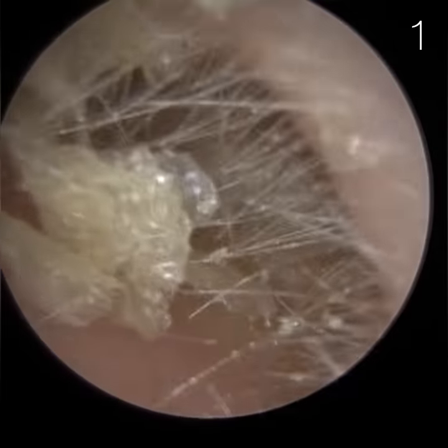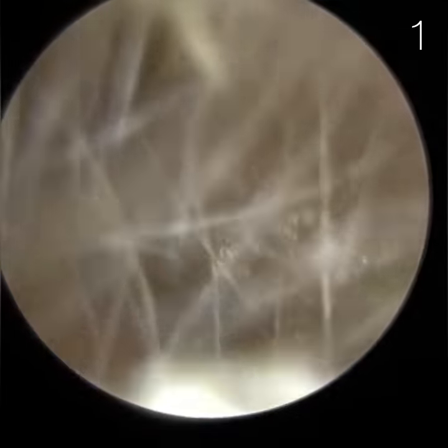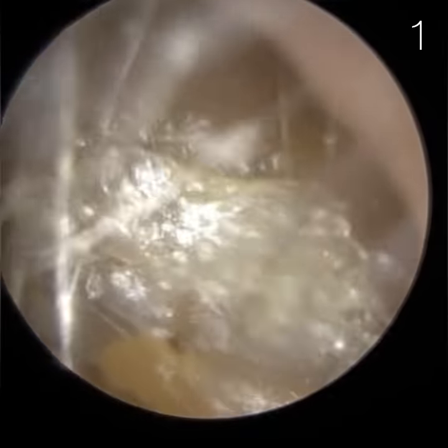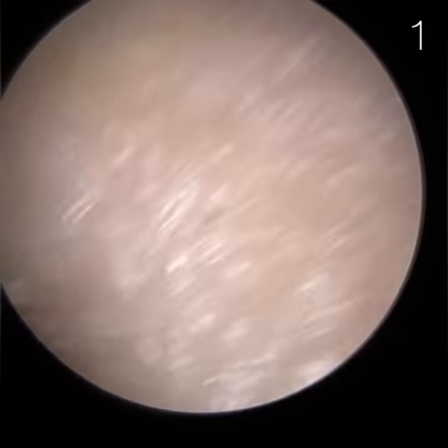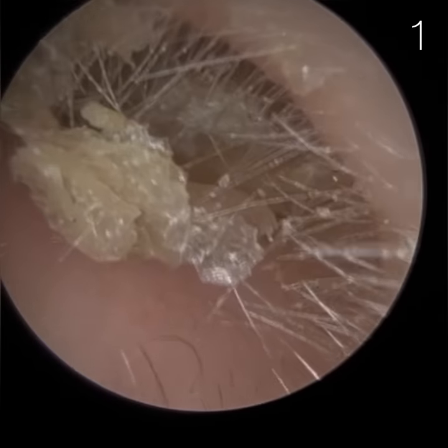Hi everyone, this is Neil Reiteter, also known as The Wax Whisperer. Thank you for joining me in my latest video. I have a compilation video today consisting of five cases, and this is case one.